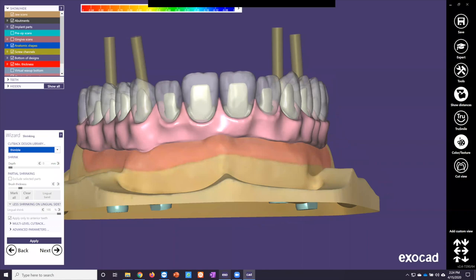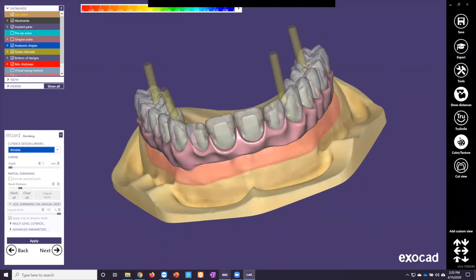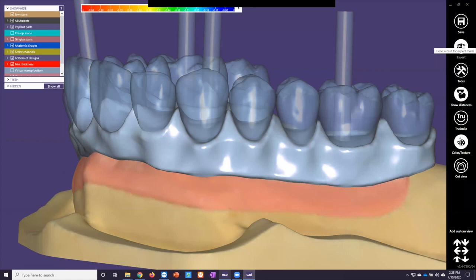One common question we get is how do we change the angulation of these? Say, for example, we're maybe doing a posterior bridge, or if this is all one unit bridge, to check if those are parallel. It's kind of visual. But at this point, if you notice the rotation's really kind of out of whack and you want to adjust that here, that'd be an expert mode tool. So I'll show you that real quick here. I'll click expert mode.